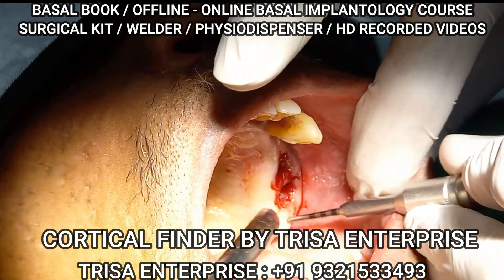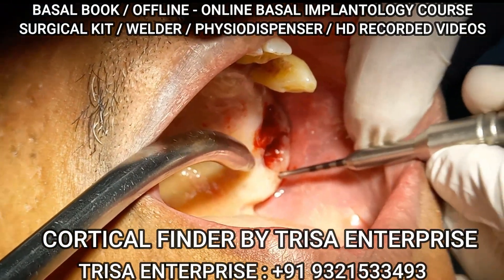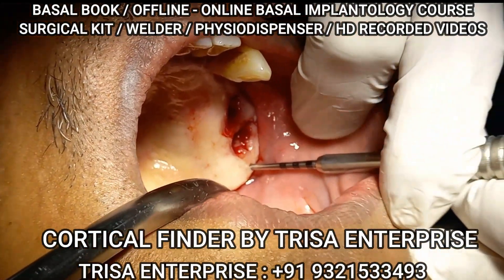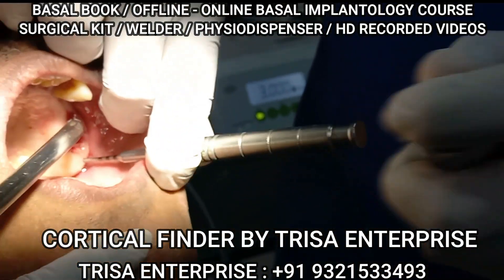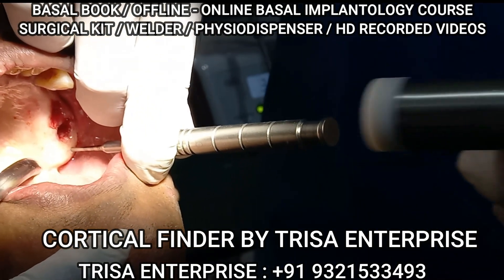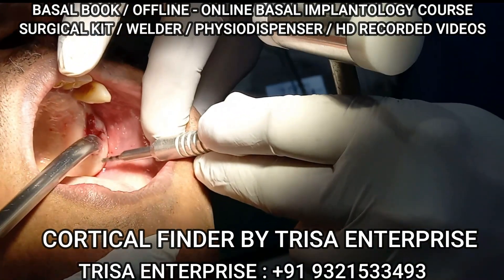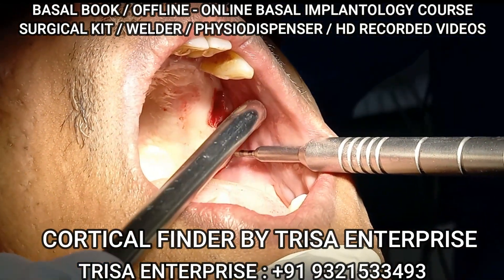I'm getting resistance — can you see it is not going in? If I would have selected here, it is still fine for this patient, no problem. Use a mallet, or any elevator or any instrument, and just snap it. So gently I'm tapping him with the mallet.